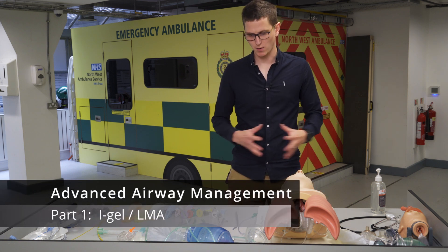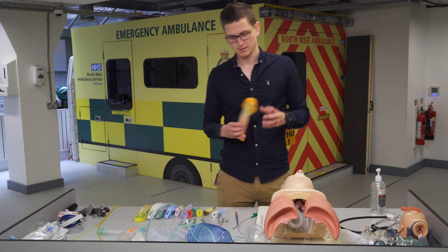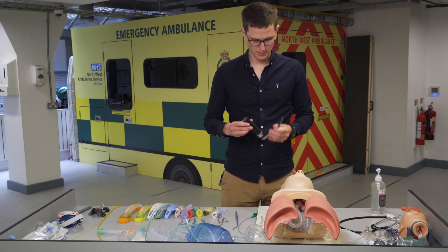Good day. Today we're going to be doing the advanced airway video. We're going to be talking about supraglottic devices, such as the iGel, and endotracheal intubation, which is the gold standard of airway management.